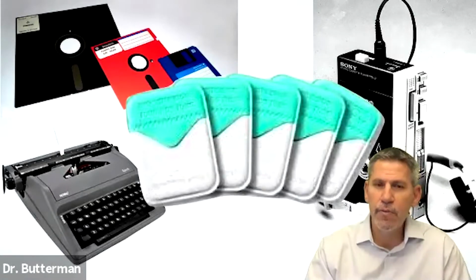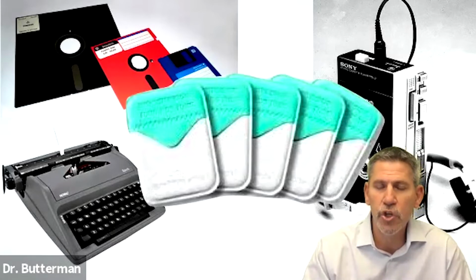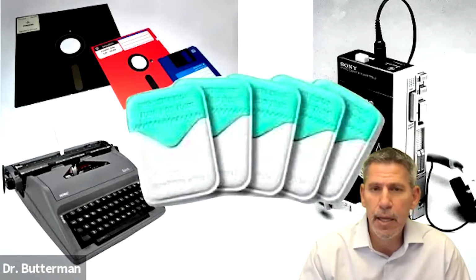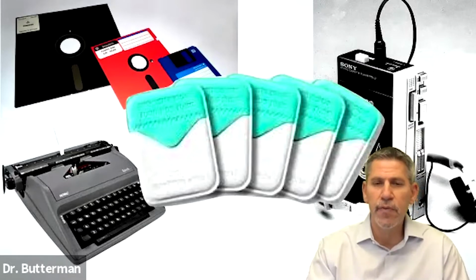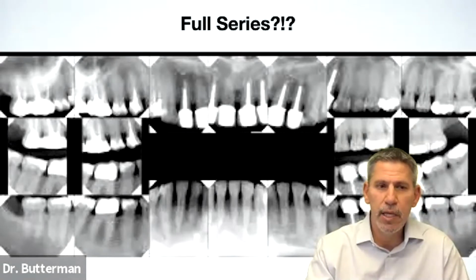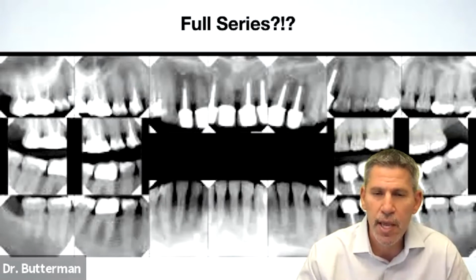And I would argue that this has become obsolete. I certainly started using film in my practice many years ago. Well, not many years ago, 28 years ago. And now I know it's still in use in some areas, but I think it's really becoming the norm that we're just not using film anymore. One of the things that I have noticed a big change with is the redefinition of what a full series of x-rays is.